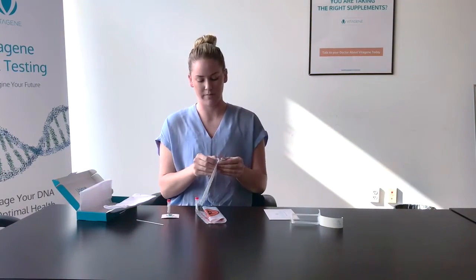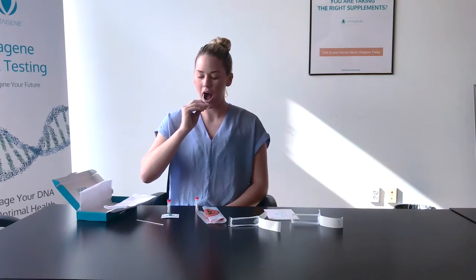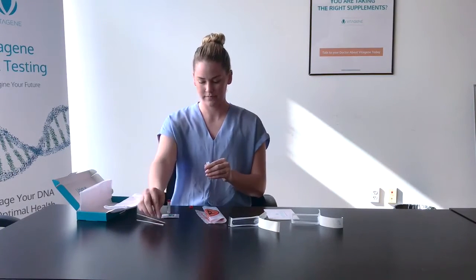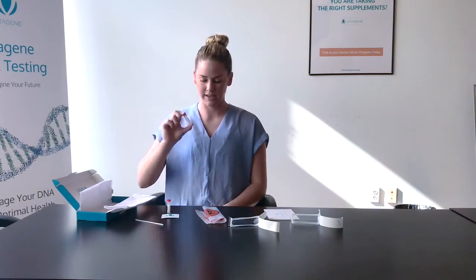Then, repeat with your second swab. Close it up and shake again for five seconds.